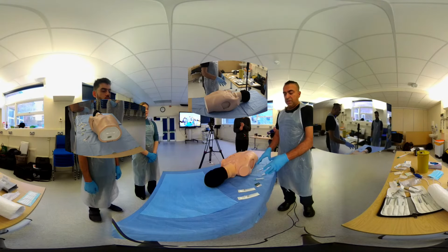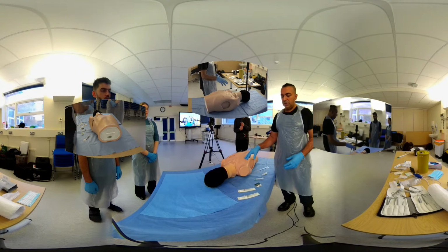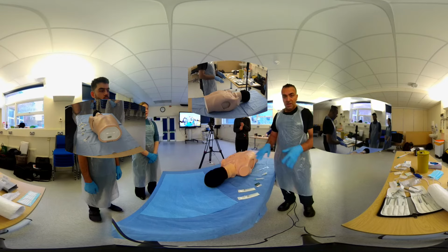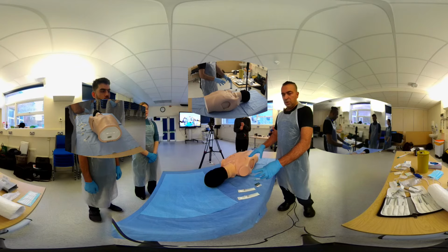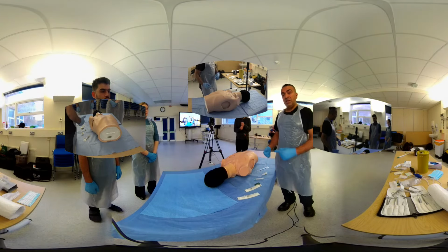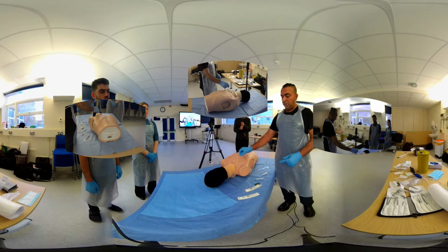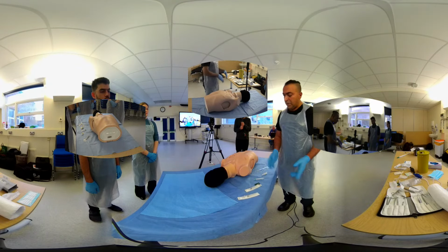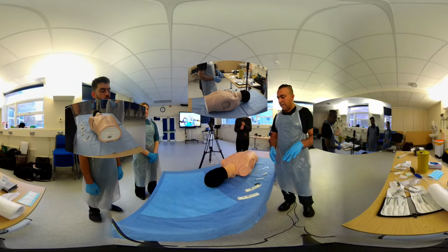The end goal is to be life-saving for tension pneumothorax, but also to work out what to do next. And the next stage, if your diagnosis is correct for tension, is always to do a chest drain. So simultaneously, if you've got helpers or colleagues, you get the tension pneumothorax sorted with the needle thoracentesis, and at the same time you're getting the chest drain kit ready, because the patient is really quite unstable while this is put in. So you don't waste time getting the chest drain kit. That's all the pre-stuff, and all of that should have happened instantly.